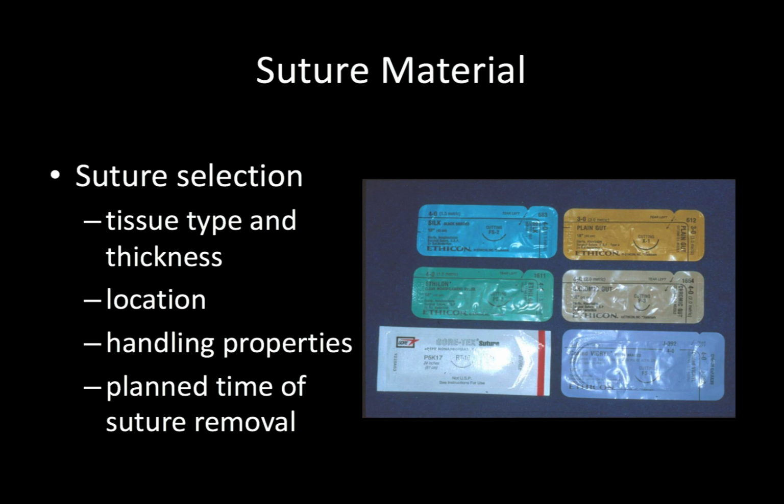There is a trend towards the use of smaller suture material and needle diameters. This trend is consistent with the desire to avoid flap trauma and minimize disruption of the remaining blood supply to the flap.